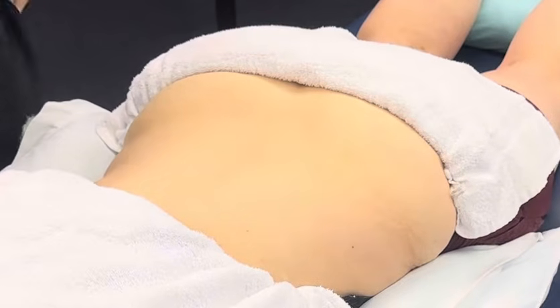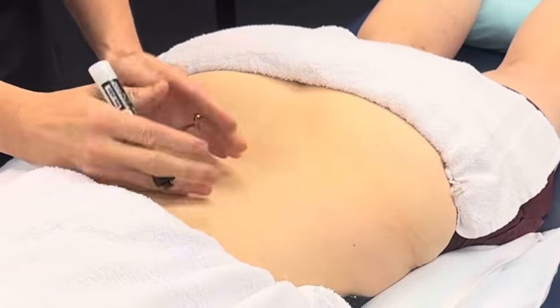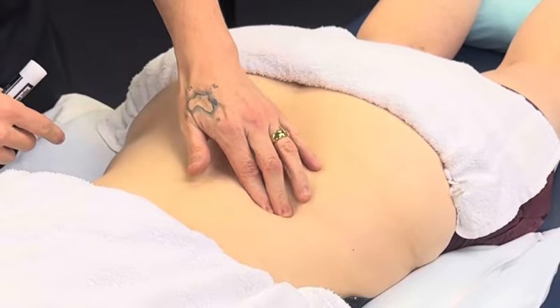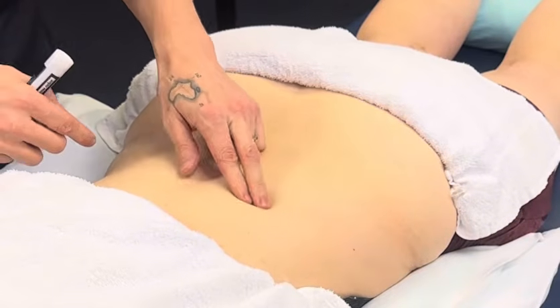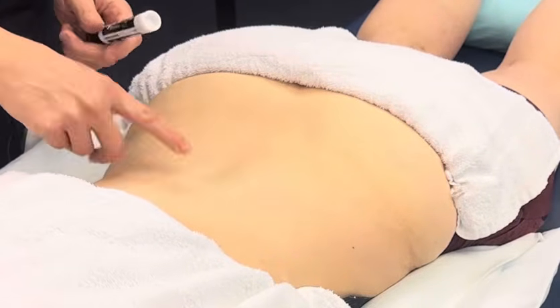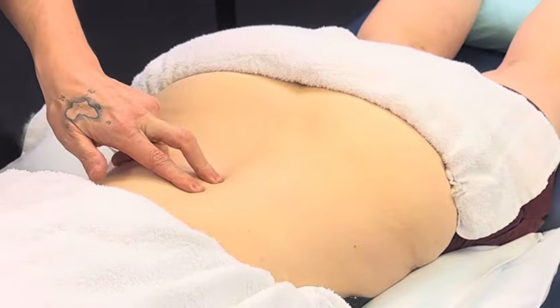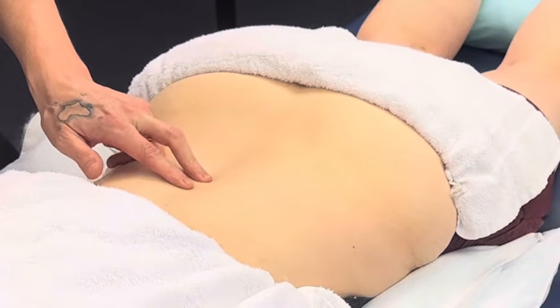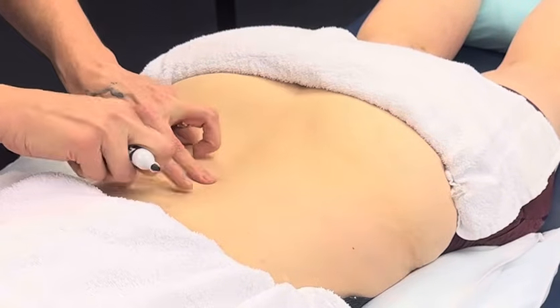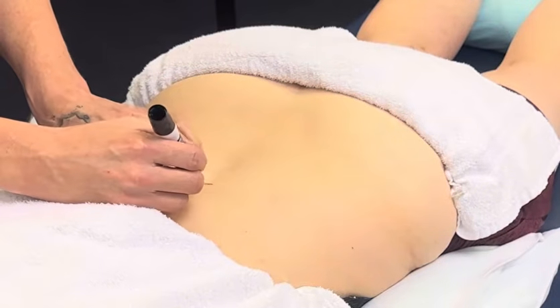Okay, anatomy tip. In the thoracolumbar area, somewhere in here. All right, where's my last rib? Okay, there's my last rib. So last rib can give you an idea of thoracolumbar junction. Also, interestingly enough, with the exception of one person in 15 years, your T12 is the most prominent spinous process in this thoracolumbar junction. It's noticeably bigger. So we can block that, right?